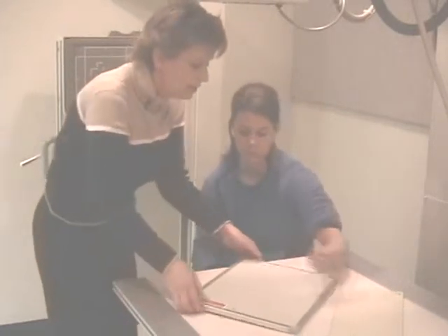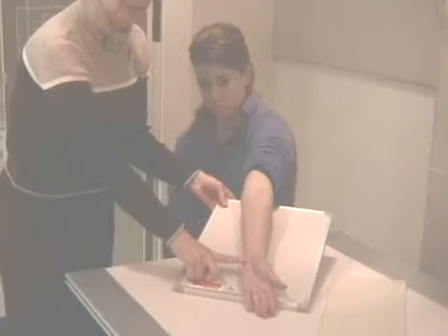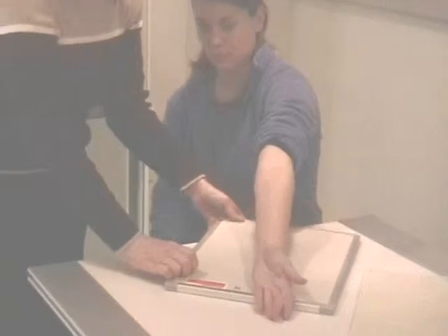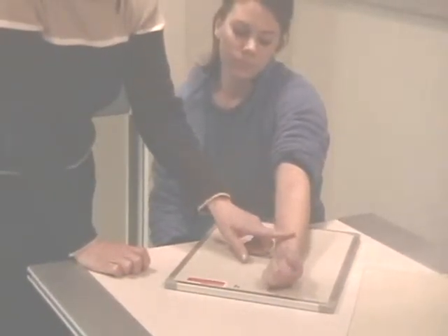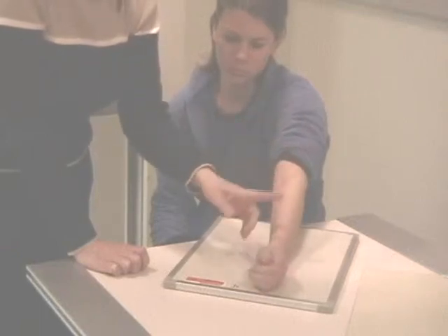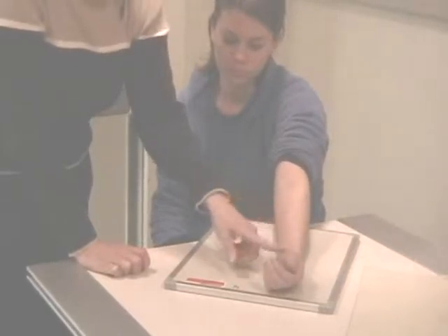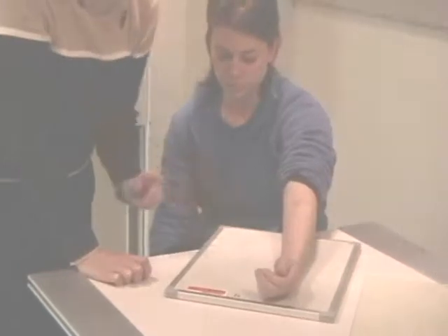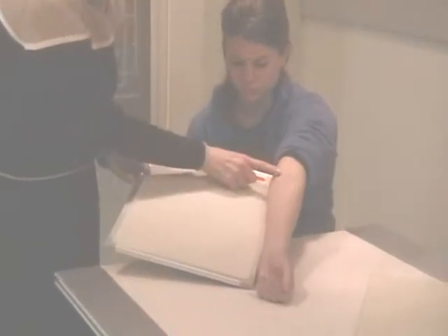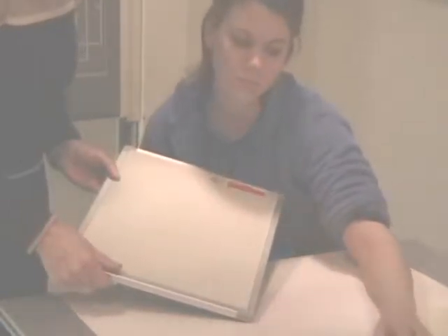Keeping that in mind, this is how my relationship of the forearm will be. ID blocker will be towards the carpals. Okay, and you can see that? Okay. If she told me that the injury, or I could see the bleeding, the swelling, the bruising, I wouldn't have to ask the patient, but if I saw it down here, what do you suppose would be the focus? The carpals will be the focus. If the carpals are the focus, we reverse the cassette, and the ID blocker will be towards the elbow, keeping the carpal bones free of any obstacle that they might run into.